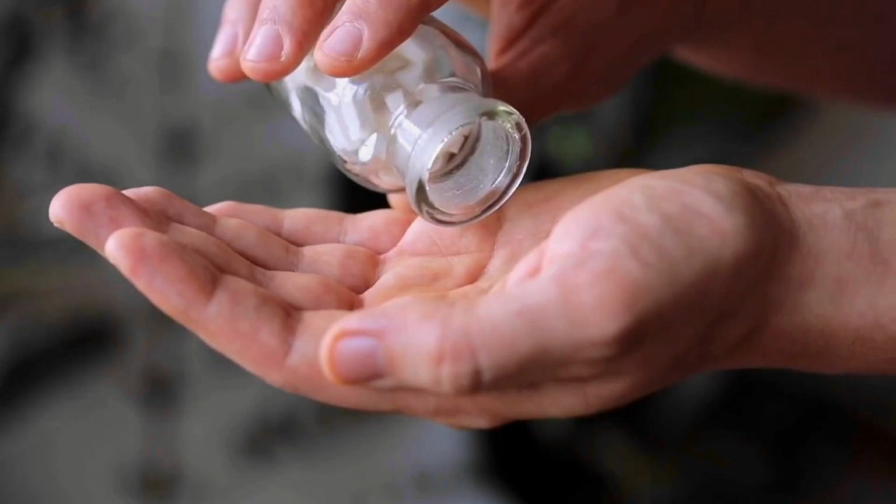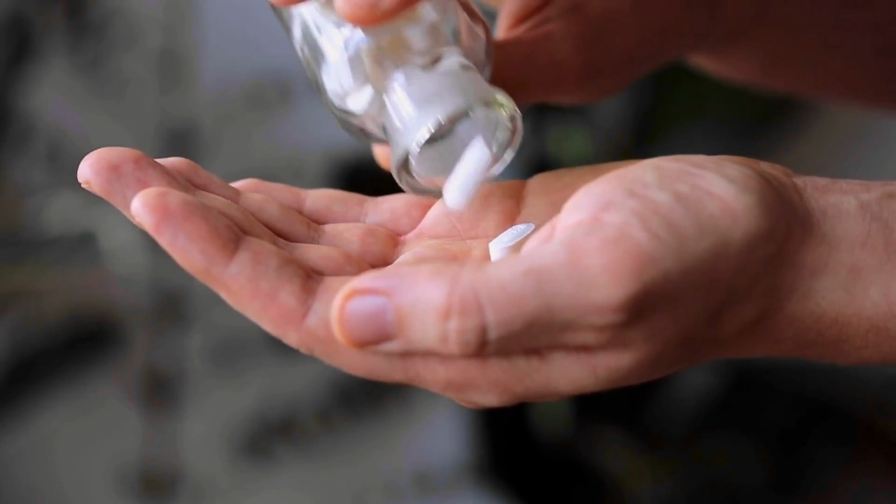Now, what do you do about the discomfort or pain? They suggest taking aspirin if you're up for that. I did. Why do you experience weight loss? Well, you're not eating as often because you have to go through the tedious process of taking them off, eating, flossing, brushing your teeth, putting them back on. You might actually eat less. When I first got them, I skipped lunch altogether. For about a month, I was very hangry.